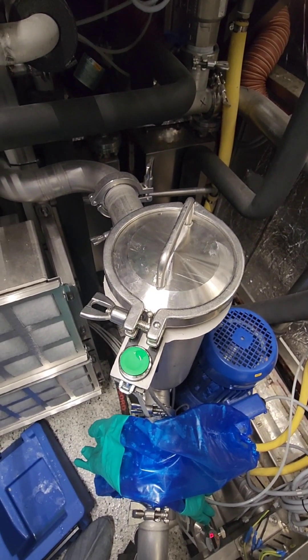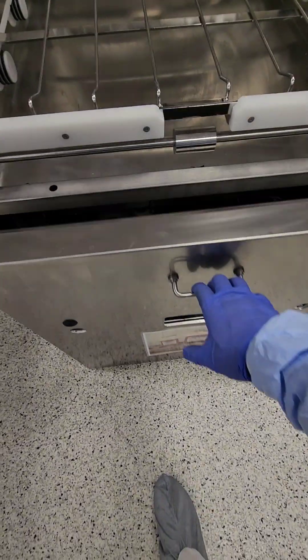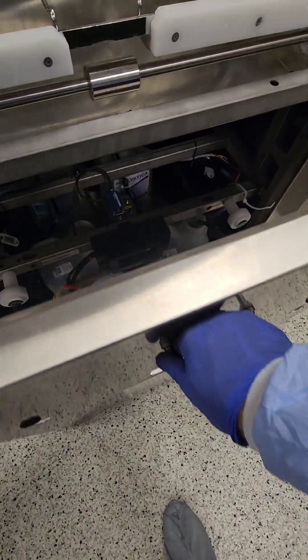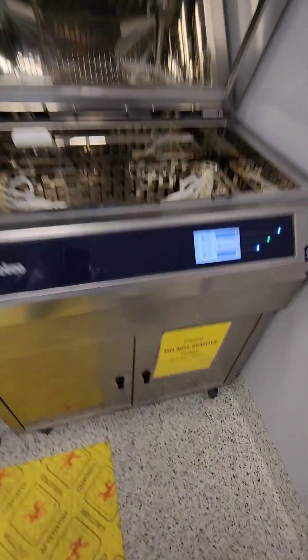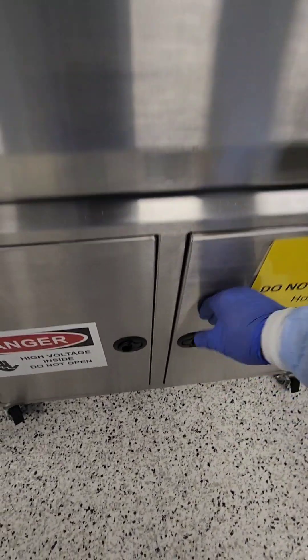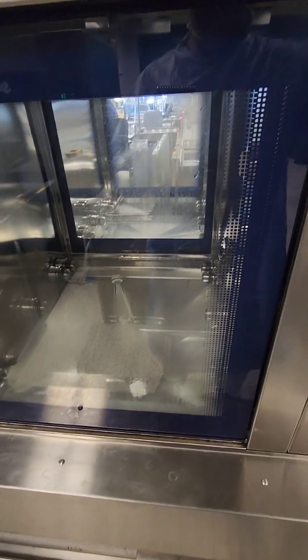On to our washer disinfector chemistry. We're going to make sure we have chemicals in there at good levels — this one's pretty good, one is getting a little low but there's plenty to start the shift. We'll also check our US 1000 large ultrasonics, which have plenty of chemistry. We have three irrigating sonics to check as well, and those look pretty good.